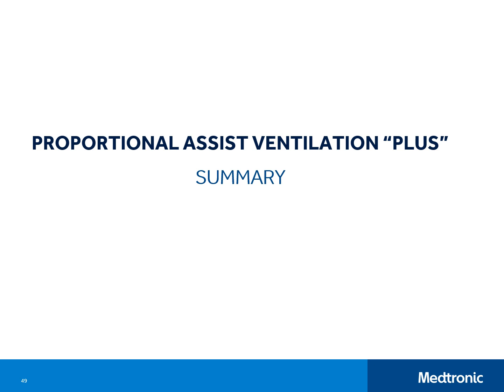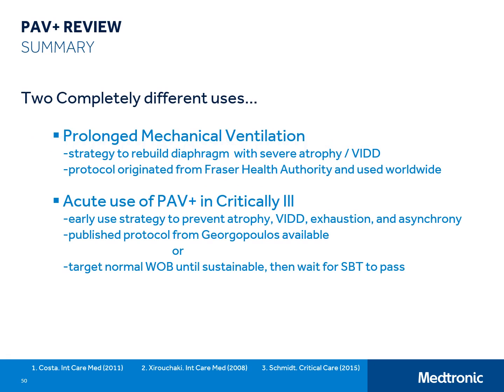As we conclude this session on the use of proportional assist ventilation with prolonged weaning patients, keep in mind that this session is not a replacement for reading and understanding the PAV Plus sections from the PB840 or PB980 operators manuals. In summary, keep in mind that this session is designed to prepare you to use PAV Plus as it pertains to the prolonged weaning protocol established by Royal Columbian Hospital.